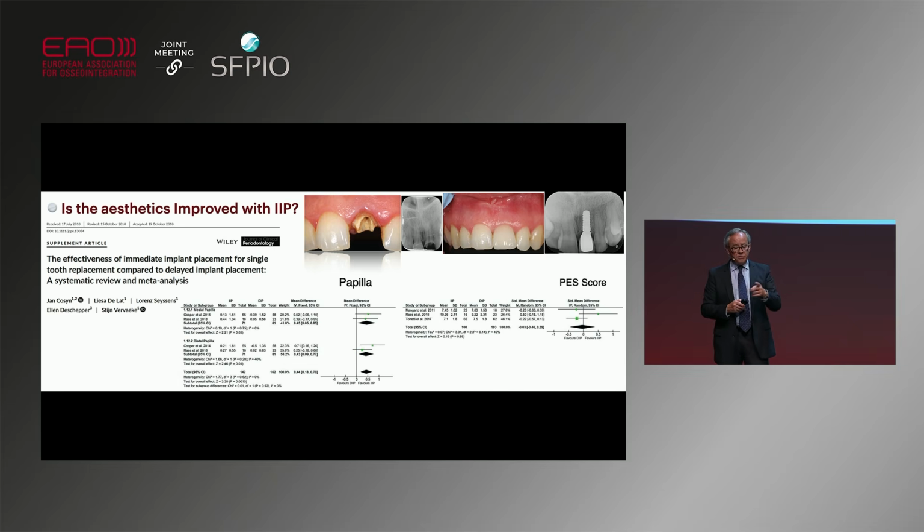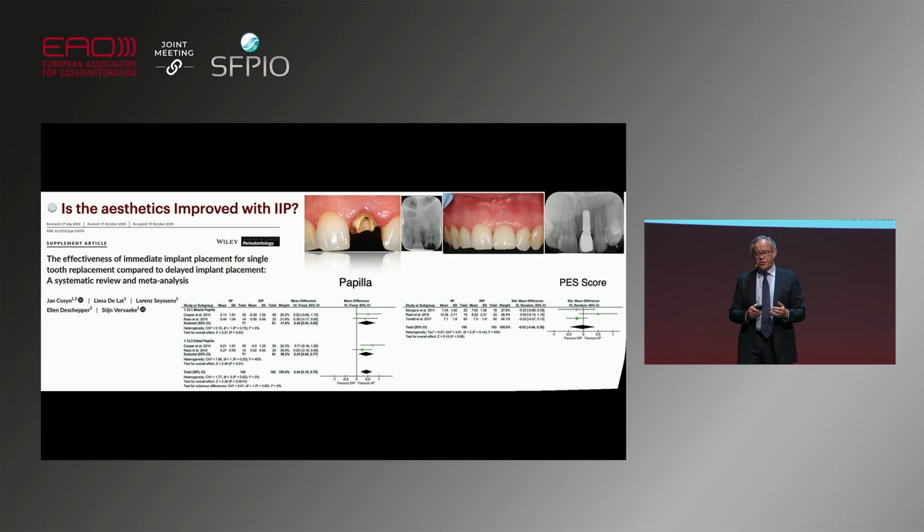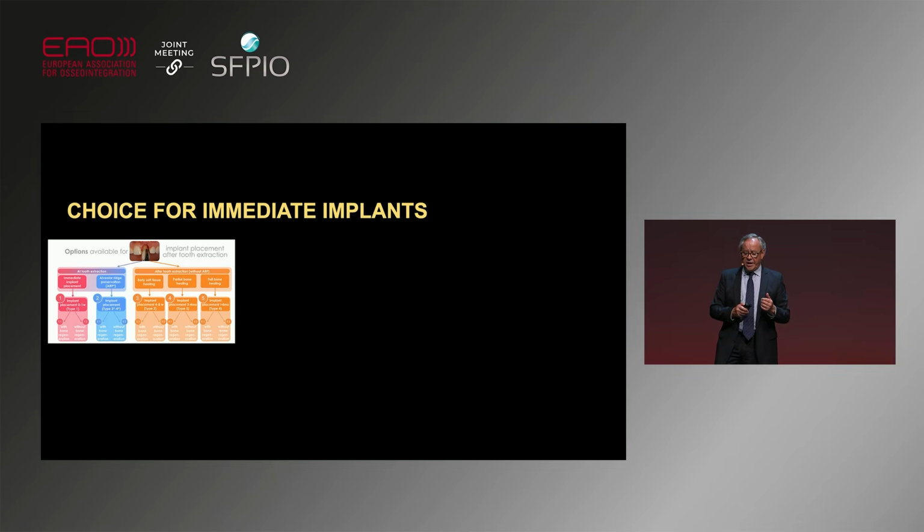And you see, in terms of papilla and PES scores, that the aesthetics is the same, including even better in terms of papilla maintenance with the use of immediate implants. So you see, the question related to aesthetics can also be overcome if we do the proper surgical protocol.